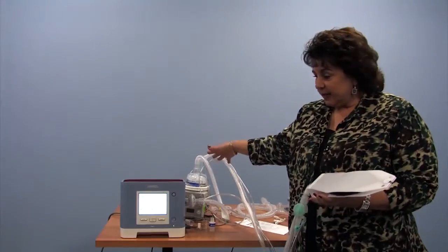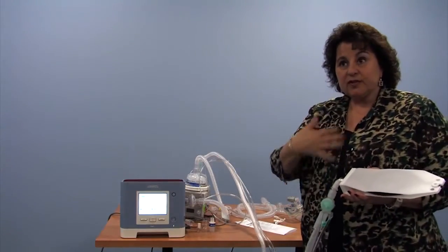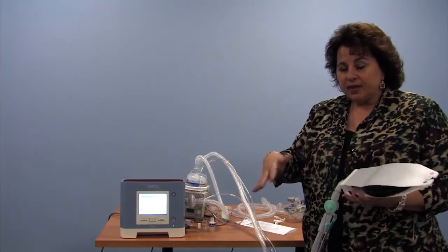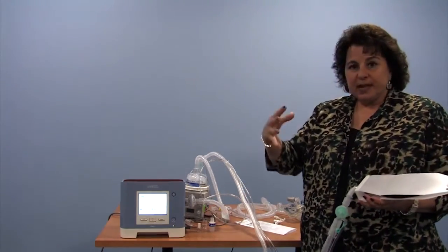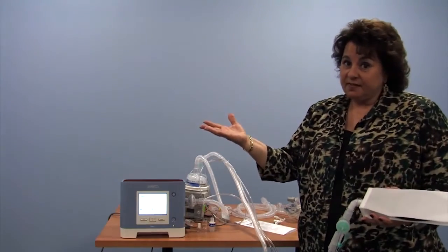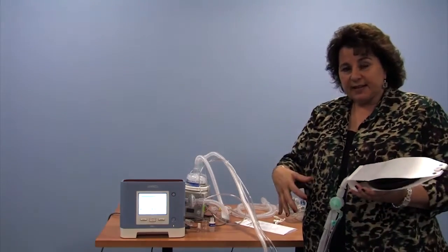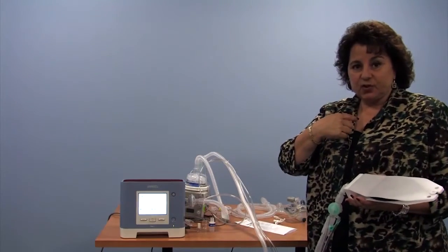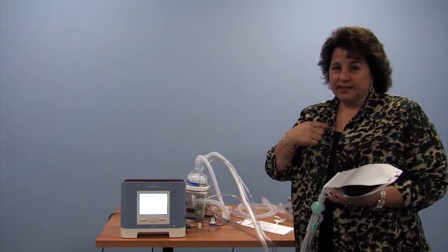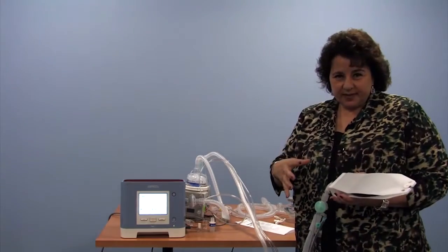The humidifier technology is advanced to the point where there are temperature probes that look at the temperature of the water and the air coming out. They look at the temperature up near your child's tracheostomy tube, and they do their best to disallow the ambient room temperature, which might be 65 or 70 degrees, from affecting the air and the heated air that we want to get into the tracheostomy tube at 98.6 or body temperature. It's not a perfect system.